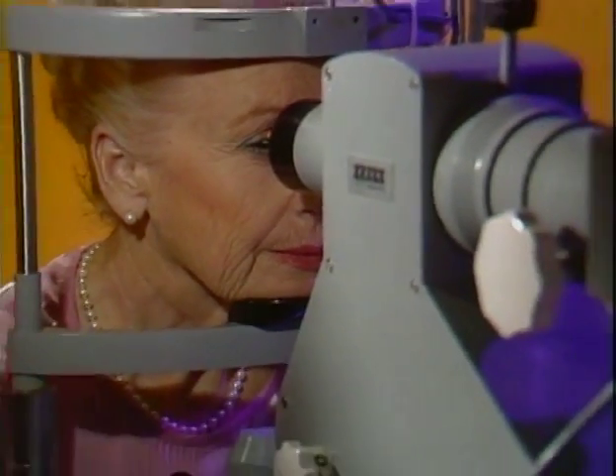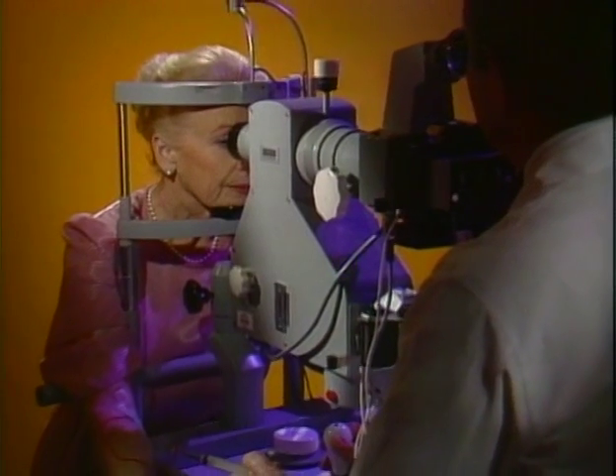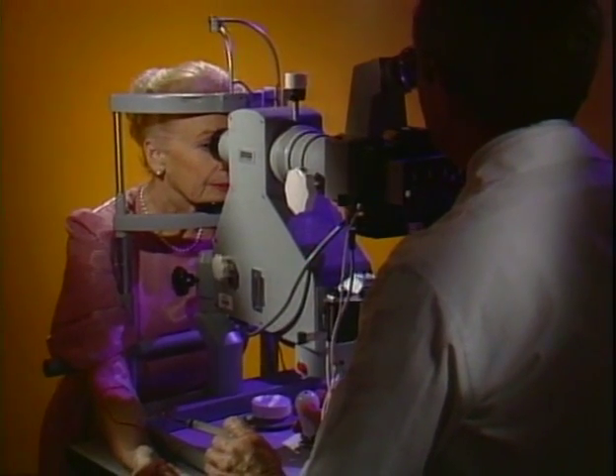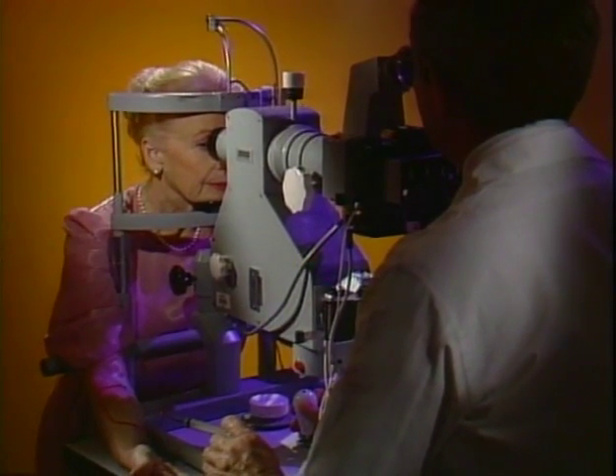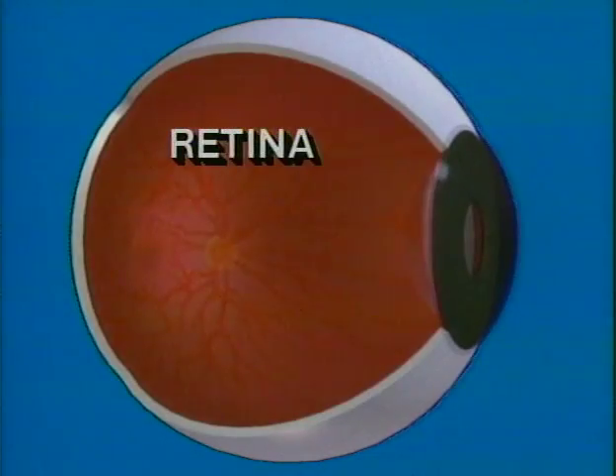Some eye conditions are best evaluated with the help of a special test called fluorescein angiography. The test involves taking special pictures of the inside of the eye. It helps find problems in the retina, a light-sensitive tissue at the back of the eye that works much like the film in a camera.